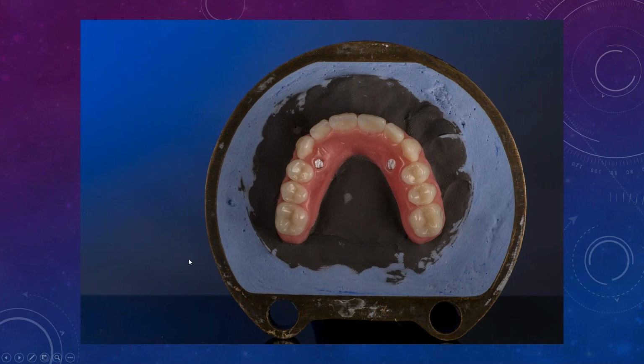If you cover this completely with stone and you go to chisel things, a lot of times you'll put undue stress from the lateral aspects onto the teeth, and you can cause micro fractures, so you can chip a tooth. But doing it this way, I haven't had issues for a long time.